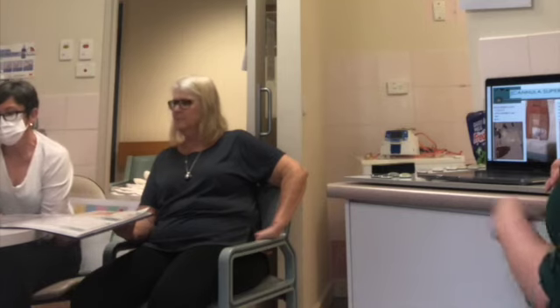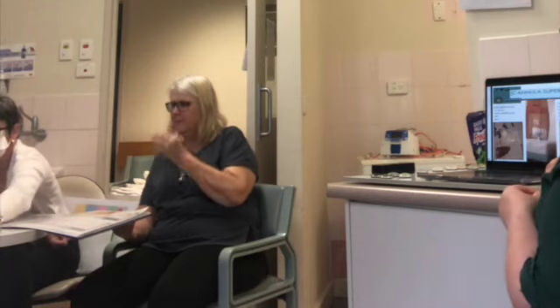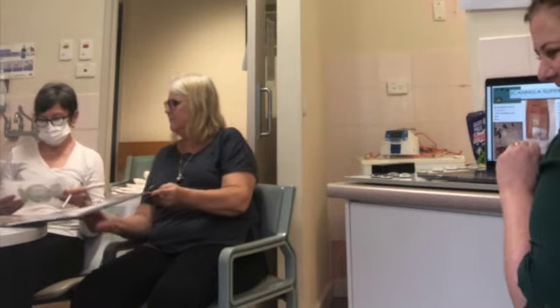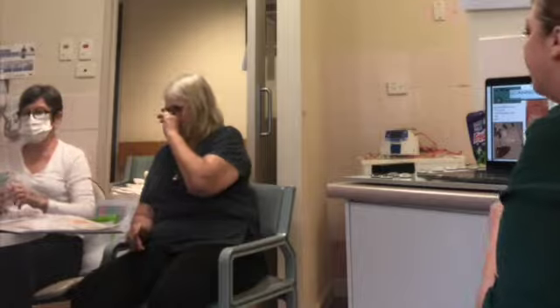Okay. There's a couple of cannula dressings on the table. Feel free to crack the 3M ones. Don't feel bad. We've only got these to use. I'm going to pull this off. So you just want to come in towards the insertion point to help prevent it coming out. Janine's bloody all over it. Lovely. Okay. Ruth's on it.